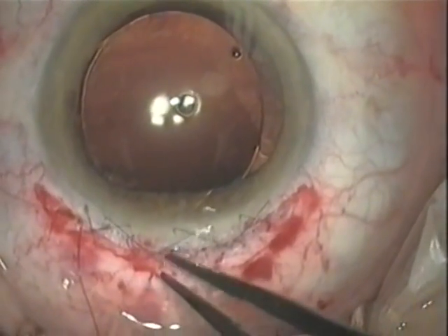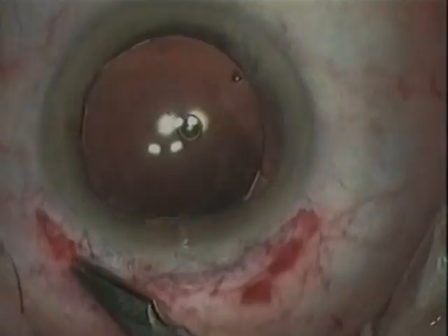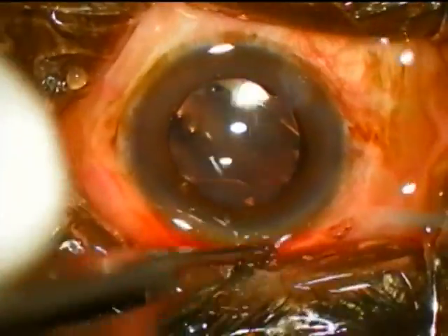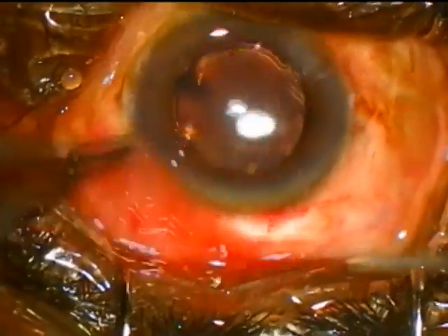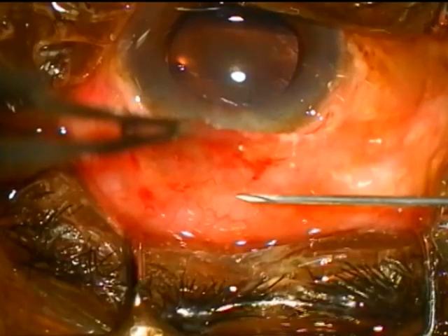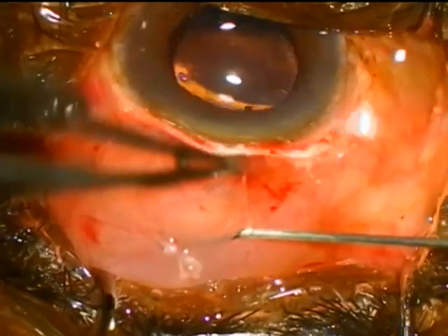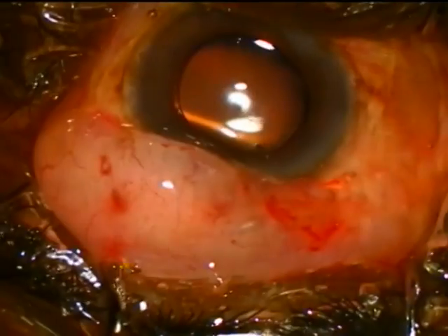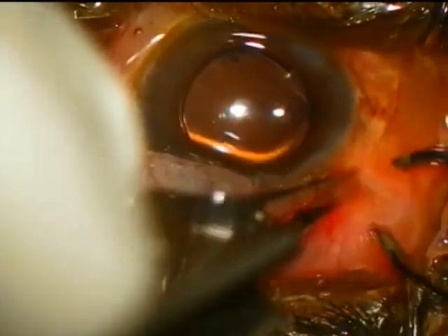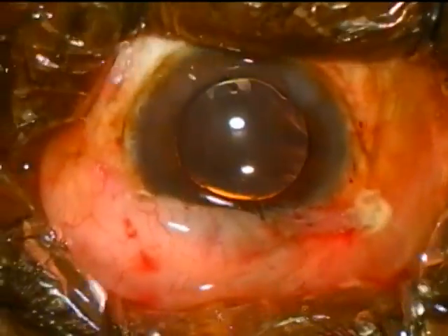The running boot lace suture is tightened before completing the knot. Finally, the conjunctival flap is brought down over the wound and secured, either with cautery or a single suture. A sub-conjunctival injection of steroid and antibiotic given into the upper conjunctival flap helps to bring it down and secure it in place.